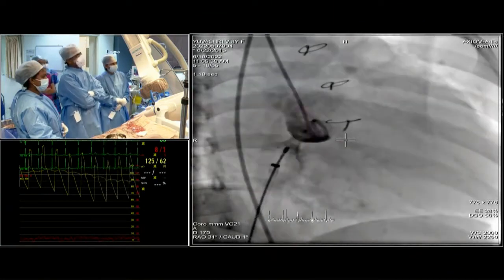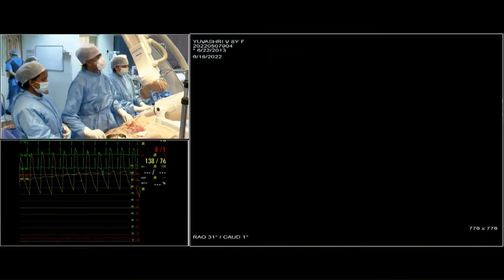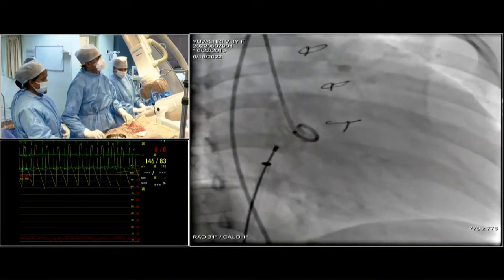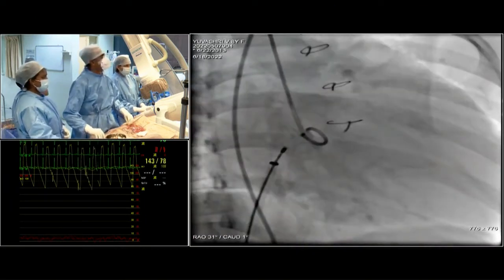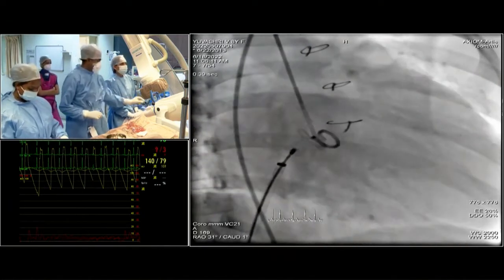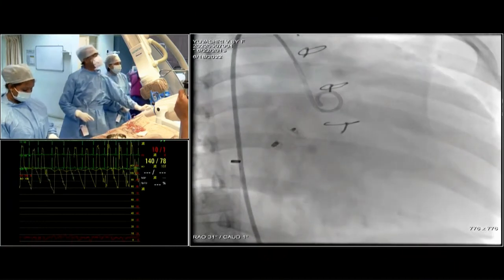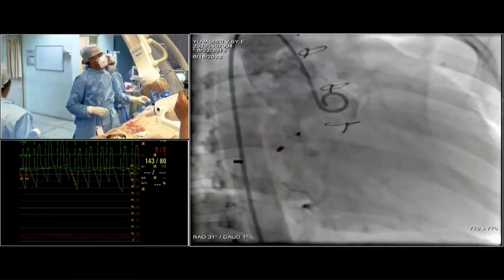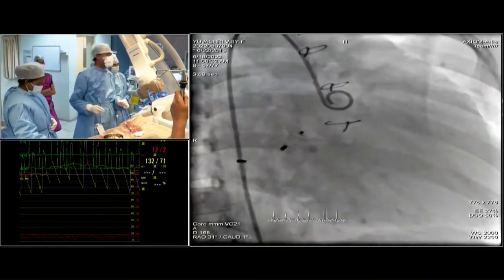The angiographic appearance looks good — very good device position. Now I am going to release it. The most important aspect is buttressing the aortic end of the aneurysm; otherwise, residual tissue remains. You must also ensure a minimal waist — no waist means incomplete occlusion or residual sac. This is a wonderful demonstration of closing a simple NCC-to-RA RSOV, one of the simplest to close with standard hardware like a pigtail catheter and Judkins right.